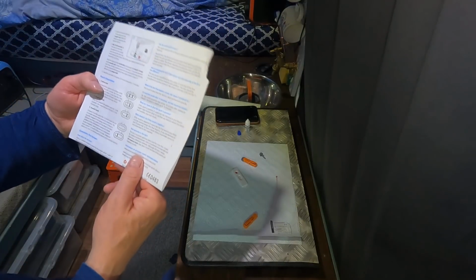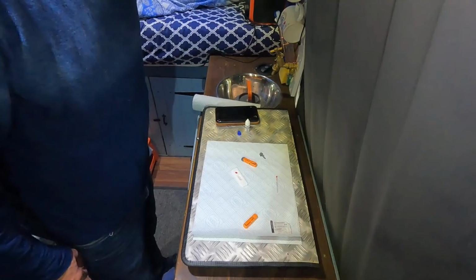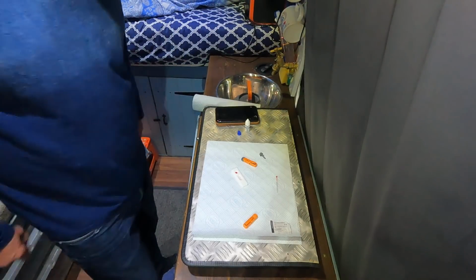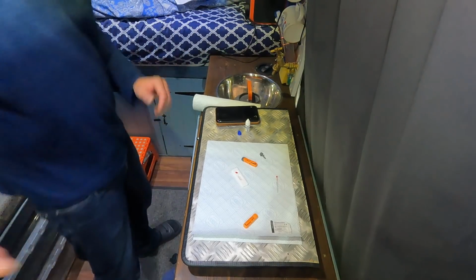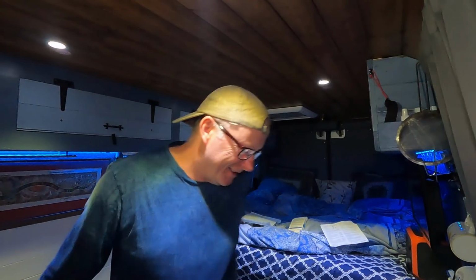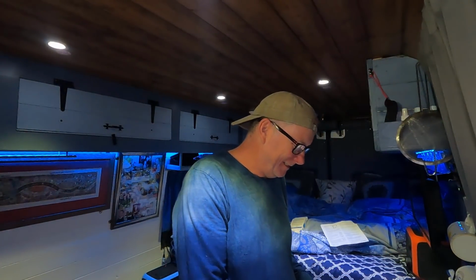Right. So I guess we just have to wait 10 minutes. I can see a line appearing already where the C is. So fingers crossed. Well, wish me luck, and I'll get back to you in 10 minutes. The clock is ticking.